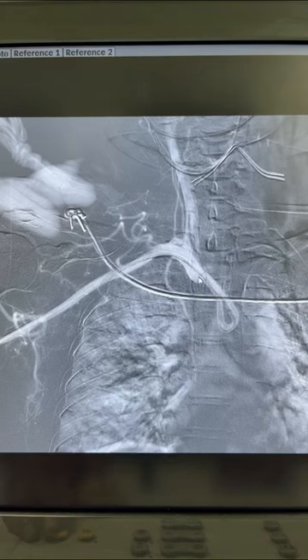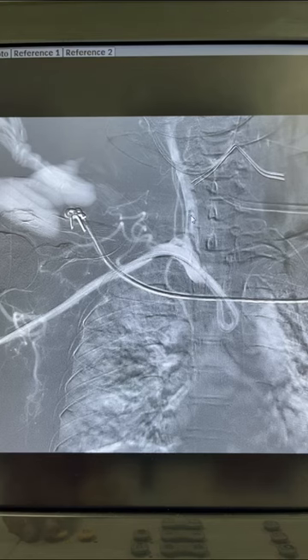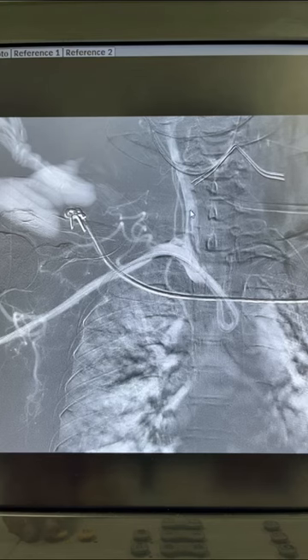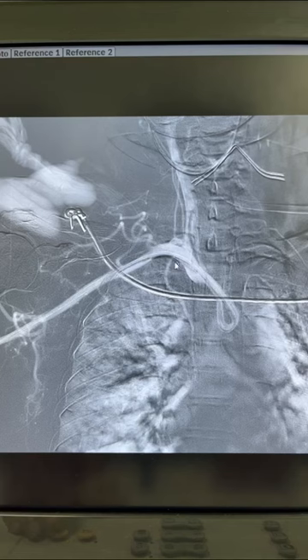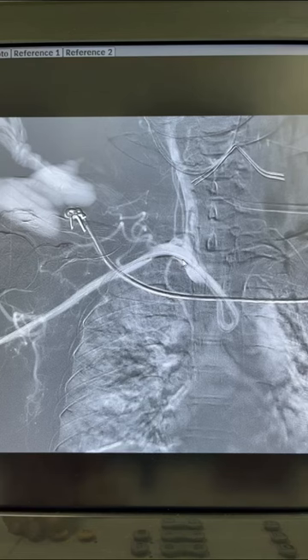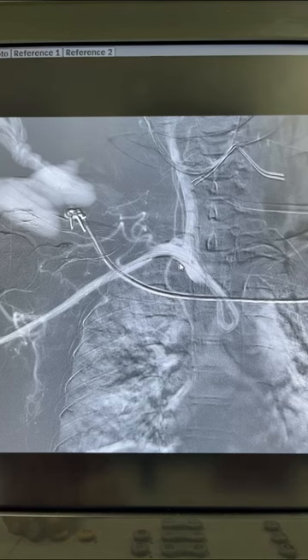So when you just pull it back, it will engage into the right common carotid artery without the wire. It is so easy to engage the right common carotid artery from the radial route using this technique.